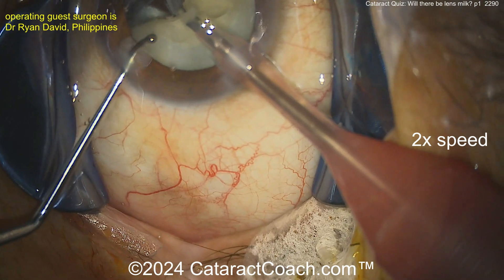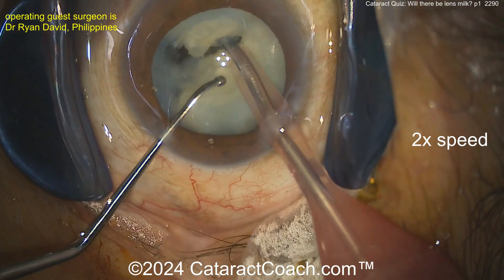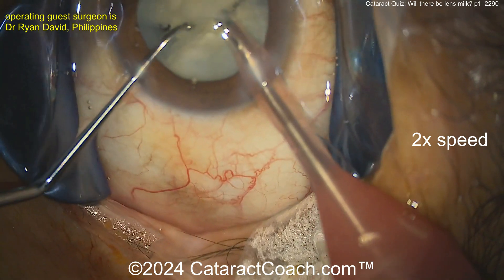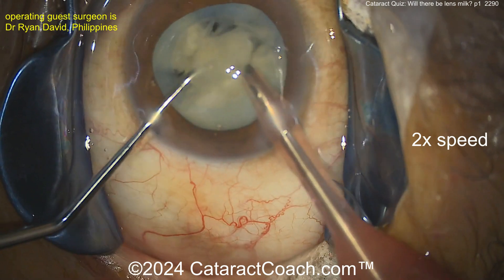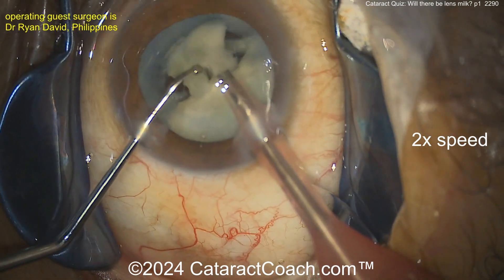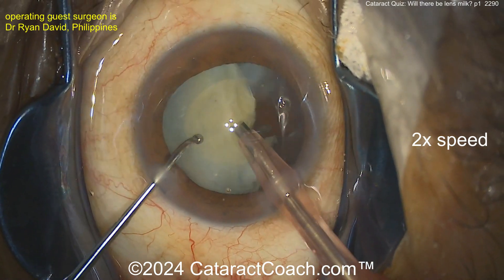Another chop, and then take these pieces out - the rest of the case can be pretty routine. Sitting temporally, looks like good exposure, drapes are good, eyelashes are out of the way. Get that piece buzzed in, bring that piece up, chopper going around it - there it is. You've almost removed the first hemi-nucleus. The second hemi-nucleus will come up pretty easily. Not a real dense cataract, just one of these white cataracts without too many brunescent features.